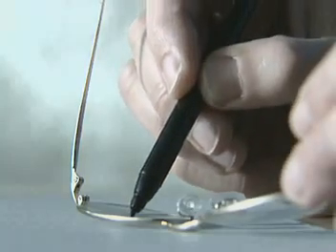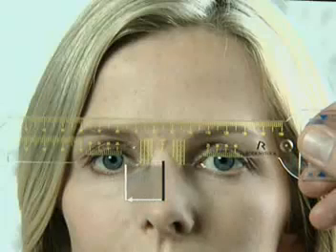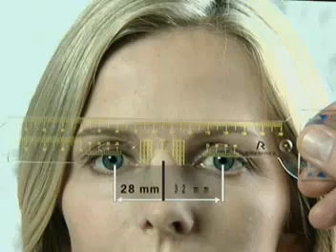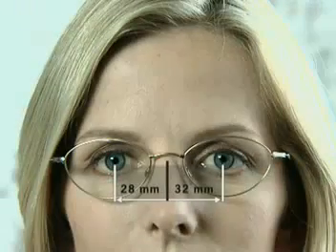Now transfer the values to the dummy lenses and recheck the result with the marks on the lenses of the fitted frame. Because the critical feature for the calculation of Impression ILT is the distance from the center of the frame to the center of the pupil.